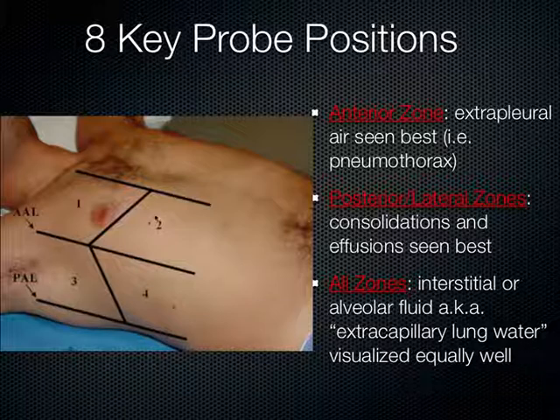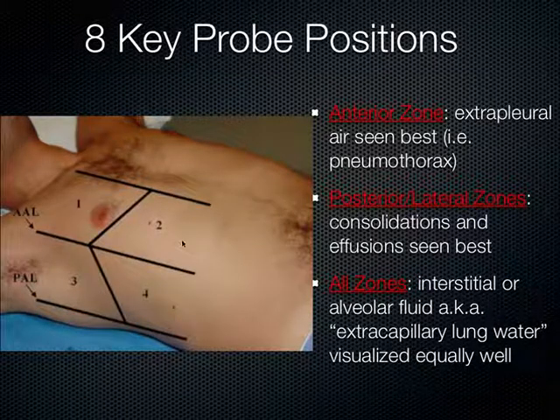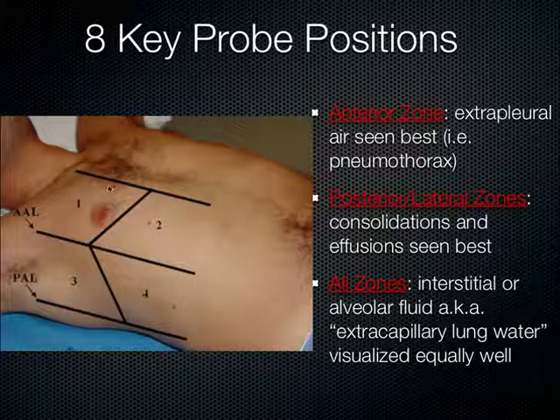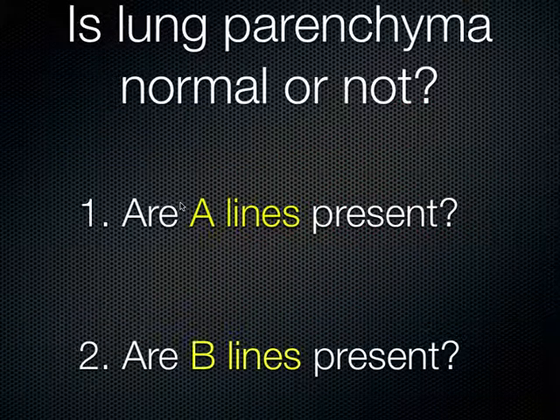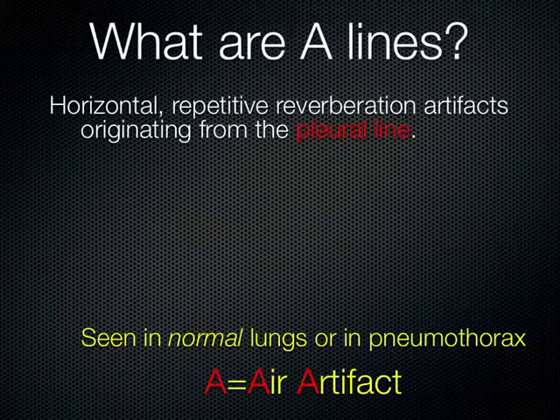This is where you stick the probe when you're doing one of these lung ultrasounds. You put it anteriorly here, a little more inferiorly over here, and then more laterally here. Okay, so this is the anterior axillary line, posterior axillary line. And this is kind of what divides these areas. And the sternum is right here, so this is just sort of right parasagittal to the sternum. So that's the question you're asking yourself. Do I see A lines or B lines?